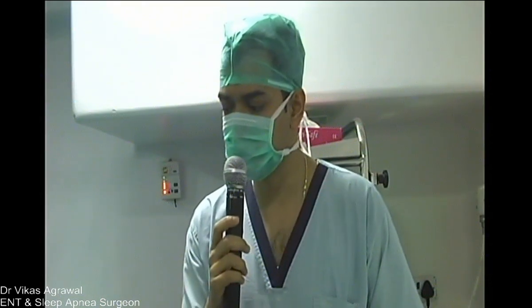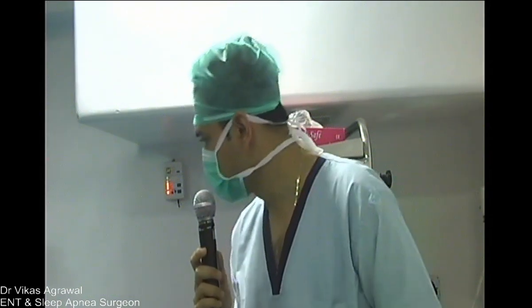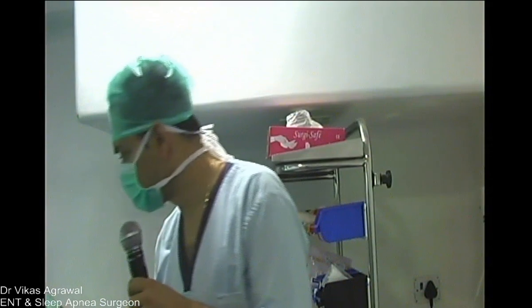A person having an AHI of 70, but whose oxygen is desaturating only till 88% or 87%, would be at a lesser cardiovascular risk compared to a person whose oxygen desaturation is almost as equal as the AHI, and the oxygen is falling down to the early 60s or late 50s. So in terms of counseling and explaining to the patient, you must highlight that your oxygen levels are falling so low, and that helps in deciding the therapy. Okay, so I think I'm ready with the surgery.